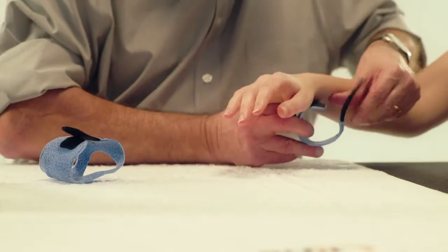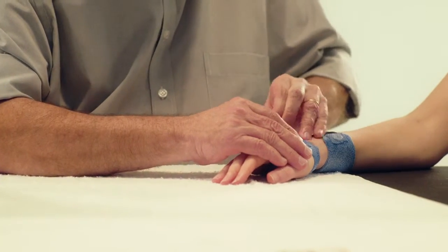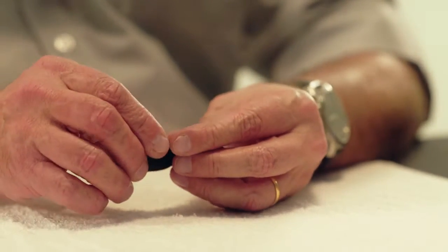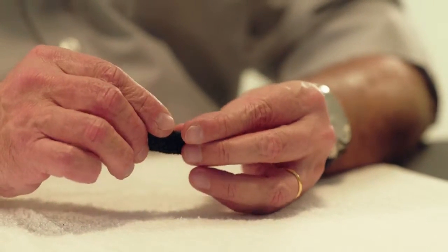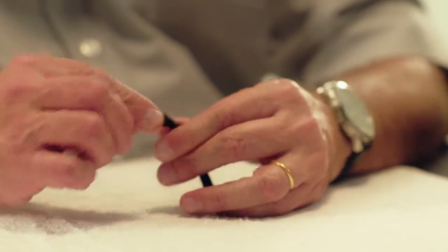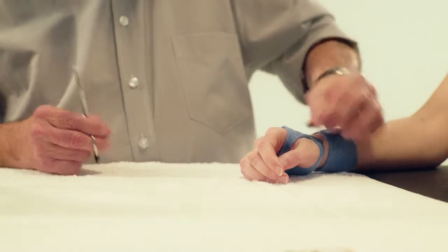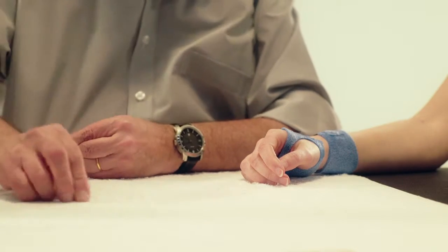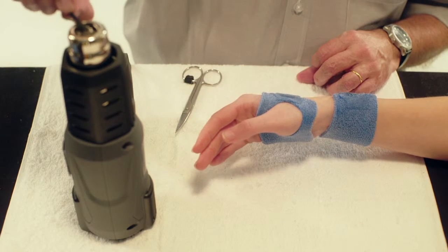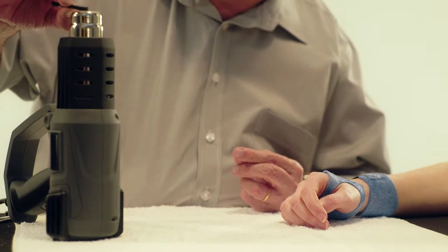Put both portions of the orthosis on the patient. Take a small strip of Orficast and heat it with the heat gun. Roll the Orficast into a small tube while maintaining a constant pressure. Fit the length of the Orficast roll onto the radial side of the wrist and cut to fit. Heat both sides of the Orficast tube with a heat gun and stick them on the radial side of the wrist onto both portions of the orthosis.